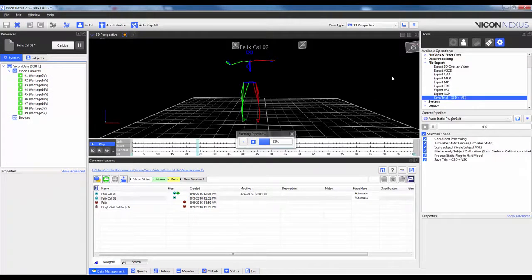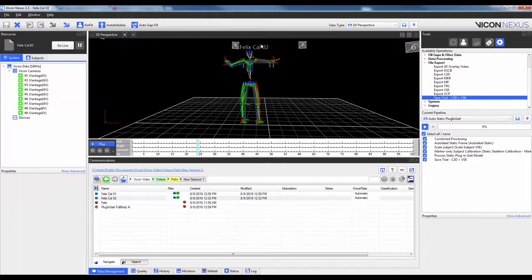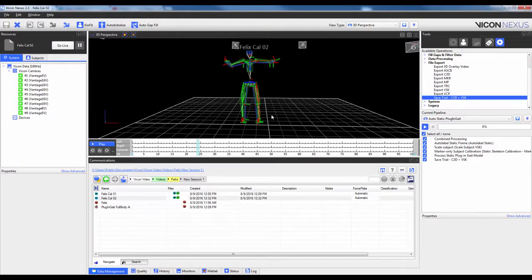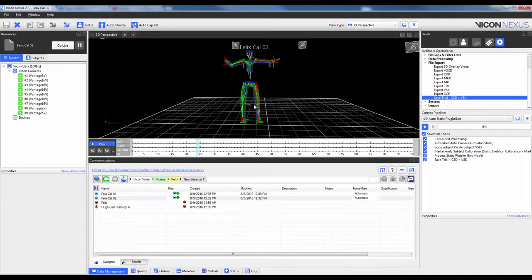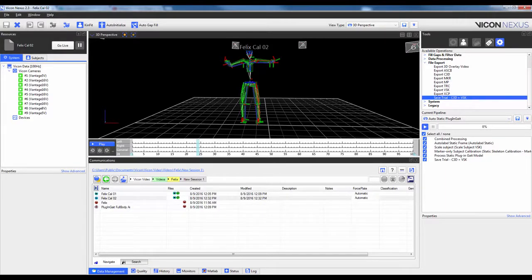You'll see that it captured the data, it's taken me offline, it's provided a different name for the trial, and it's actually processed and calibrated everything for me. Again, you will want to make sure that you can get reliable captures for your static trial before wanting to automate the process this much.